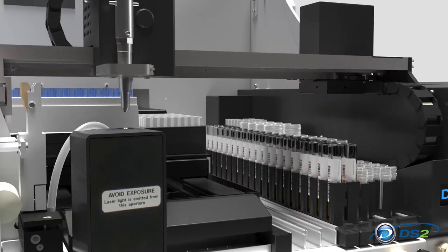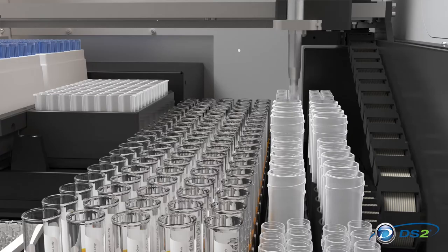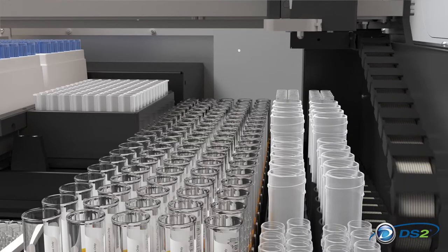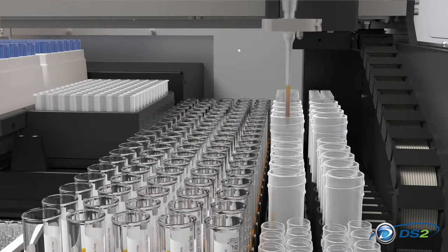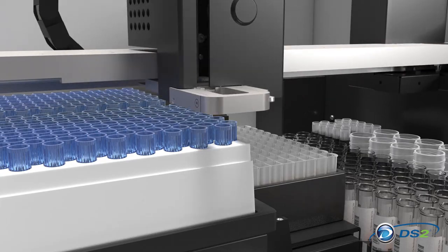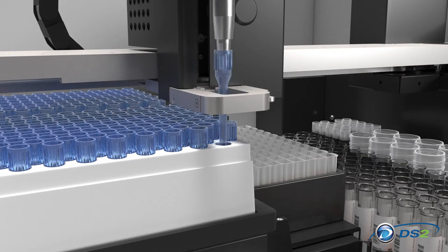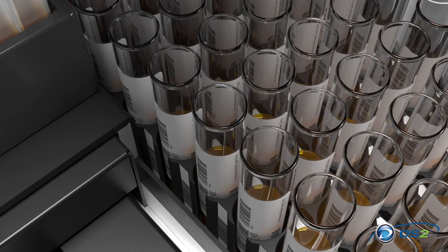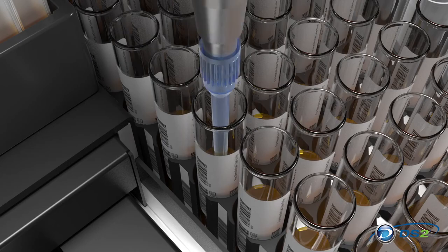With few moving parts, the DS2 was designed for simplicity, reliability, and ease of use. One multi-function robot arm does everything with efficiency and accuracy.